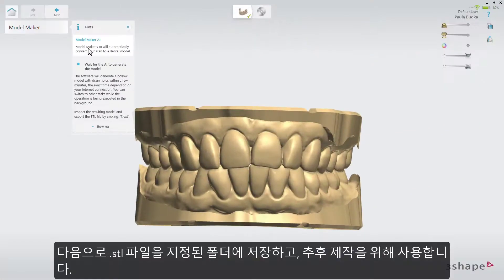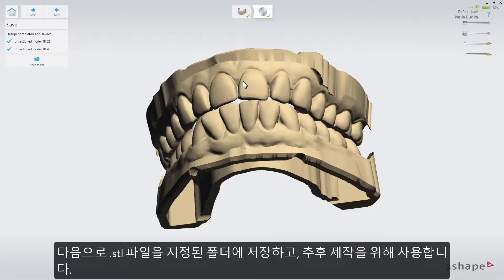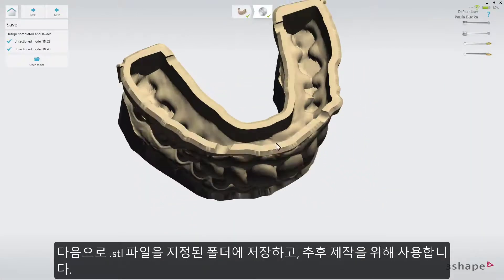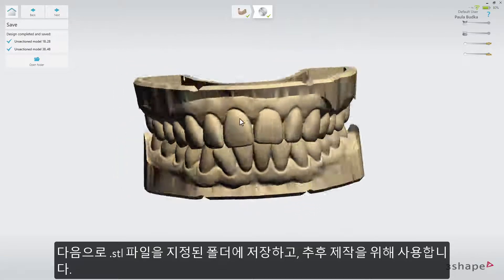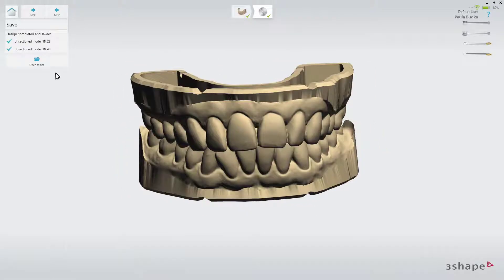The next step is to save the STL files in the designated folder, and use them later for manufacturing.